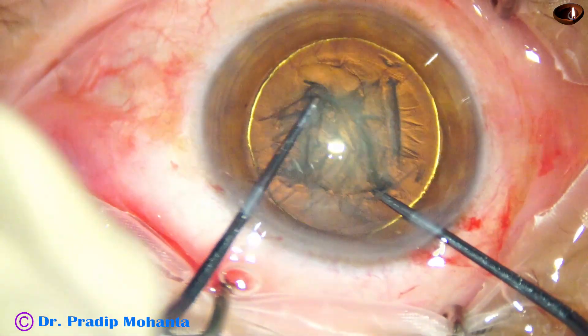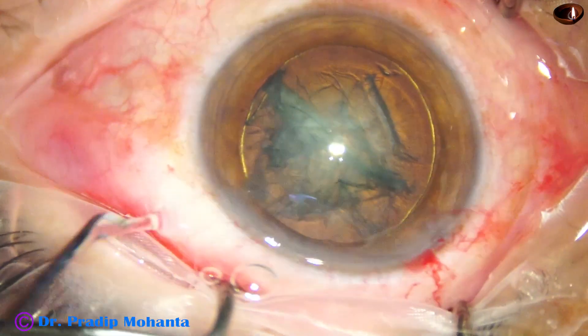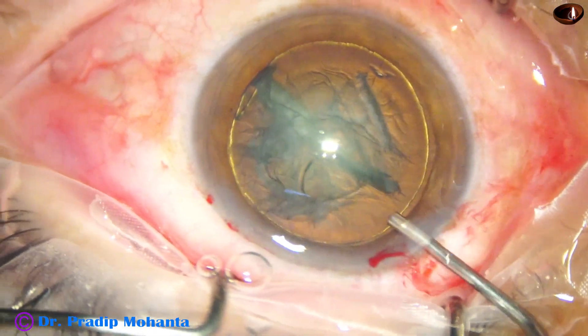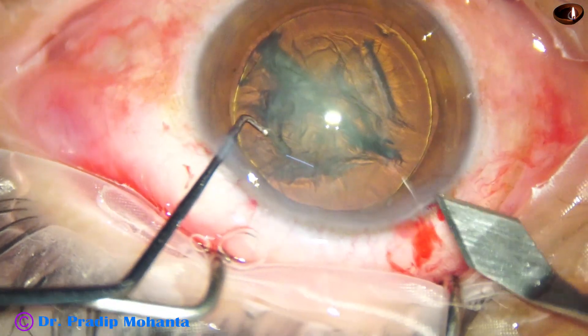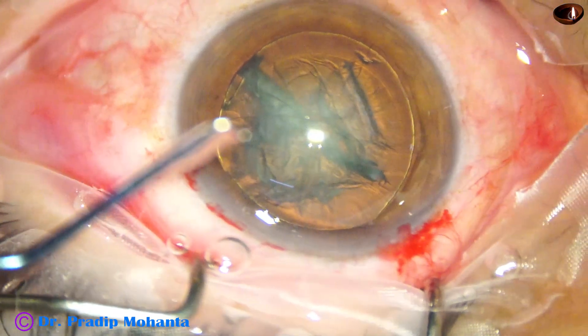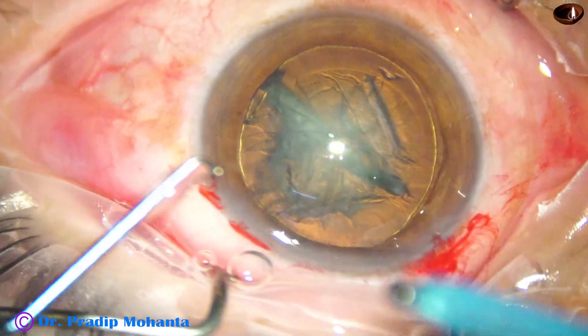I tried pre-chop in this case. When hydrodelineation happens, we can easily hook the equator, go along the hydrodelineation golden ring, and divide the nucleus. I have just made two hemi nuclei and now I have enlarged the main wound to about 3 millimeter.